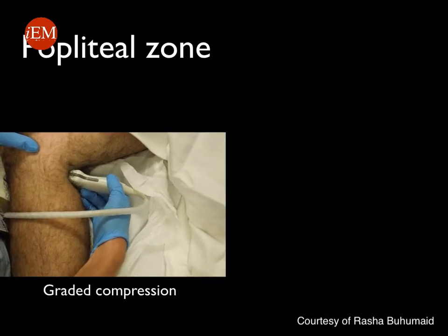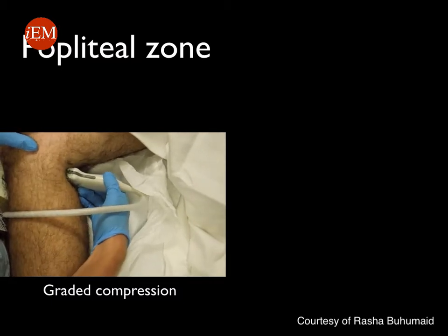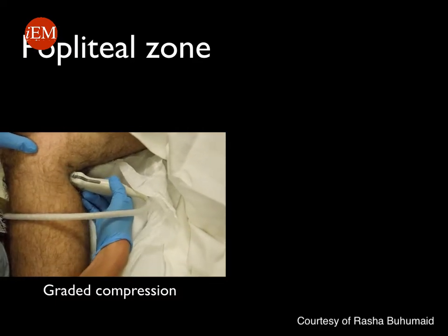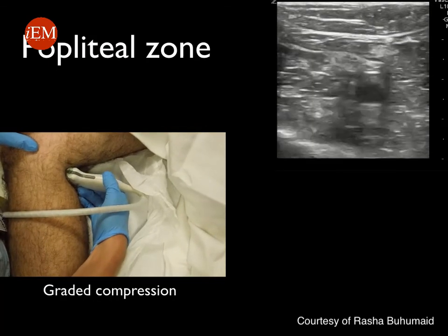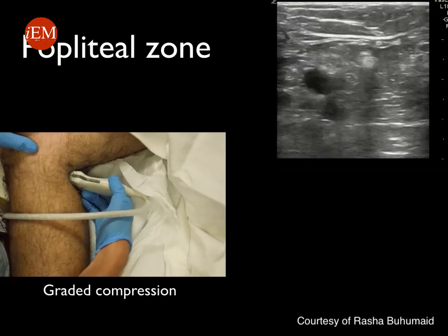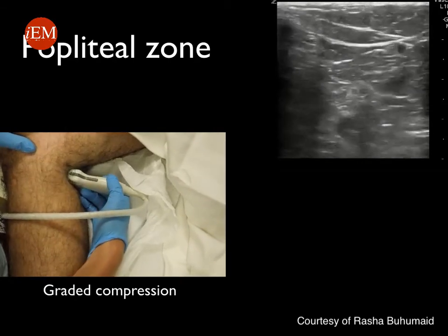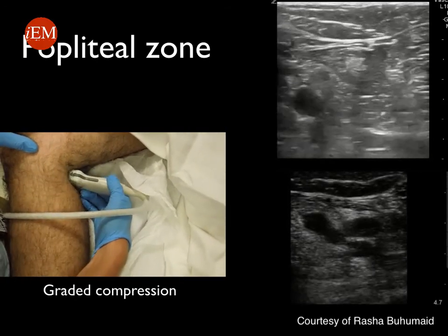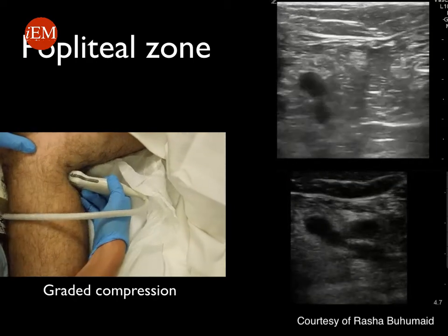At the level of the popliteal fossa, the popliteal zone is evaluated by placing the probe in a transverse plane with the probe marker towards the patient's right. You can see the sonographer performing graded compression, applying pressure to ensure the walls of the vein are collapsible, which rules out DVT in this area. It's important to follow the popliteal vein until it trifurcates — all three trifurcation branches are demonstrated and shown to be nicely compressible.